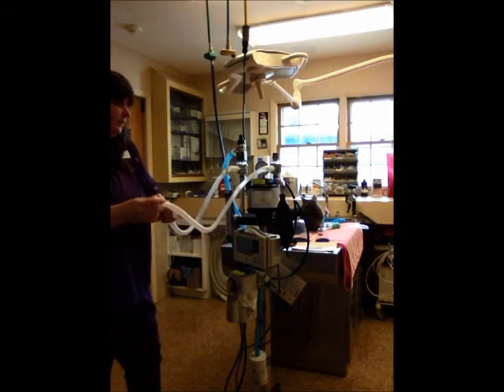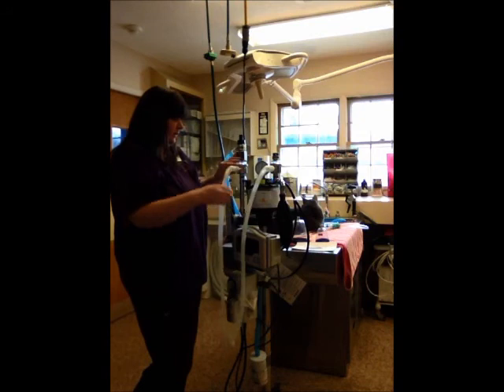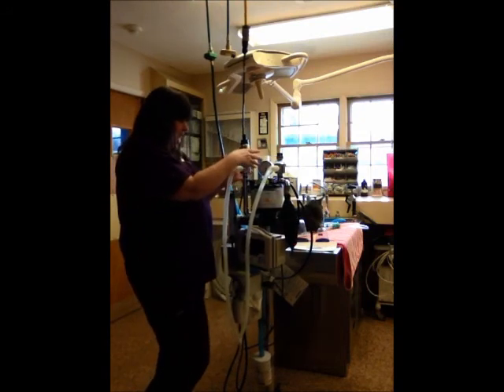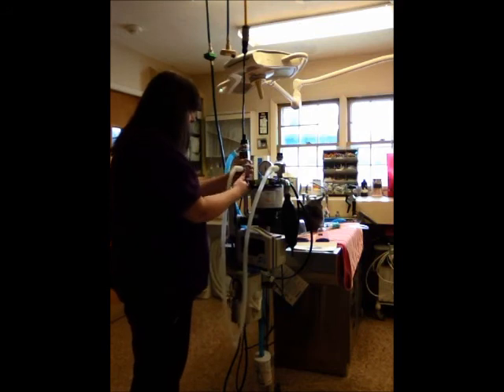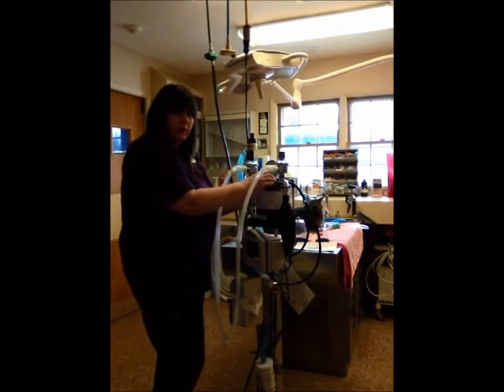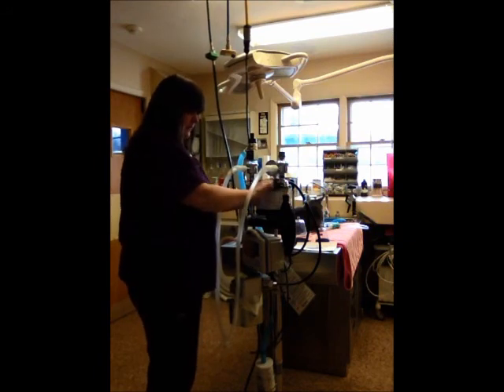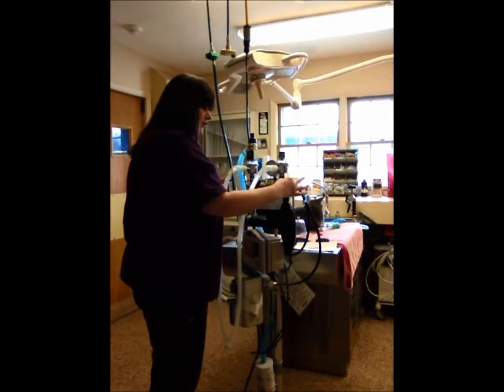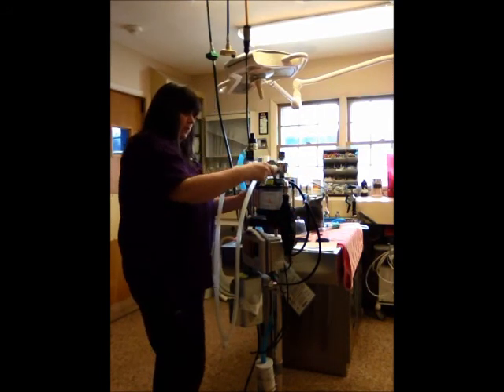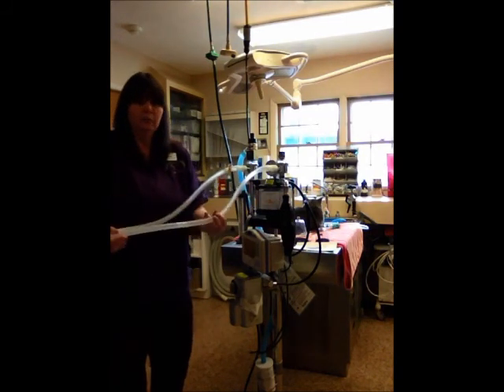When the patient exhales, the waste anesthetic gas will enter the exhalational tube and go through the exhalational valve. Then some of the waste anesthetic gas will go into the carbon dioxide absorber, removing the carbon dioxide. Whatever has gone into the carbon dioxide absorber will then enter the inhalational valve. Some of it will fill up into the reservoir bag, and some of it will fill up into the inhalational tube, entering the patient without carbon dioxide.